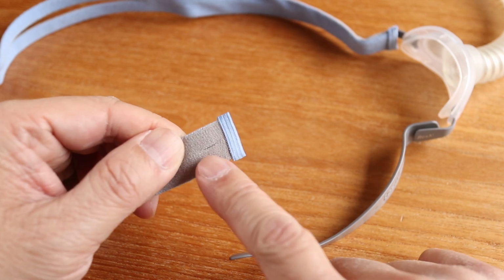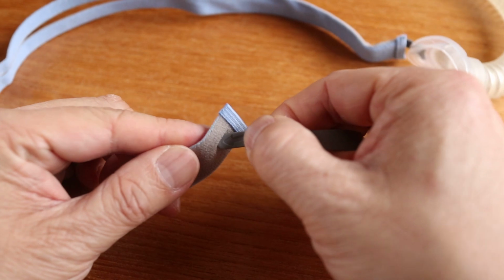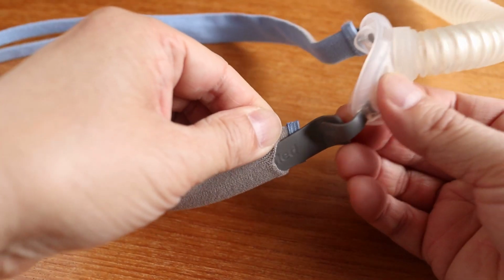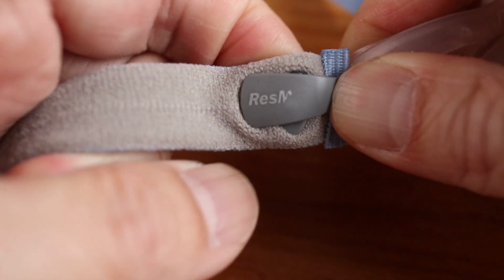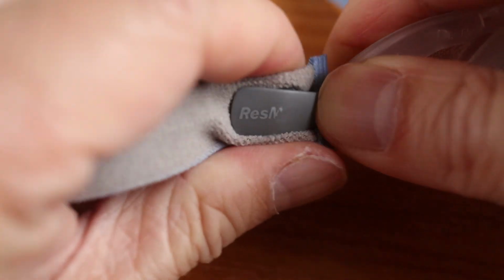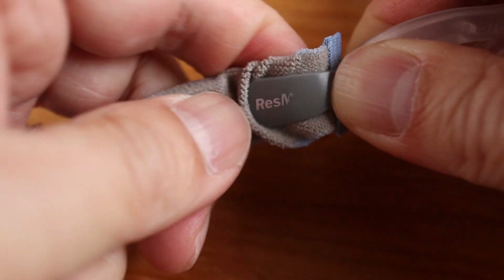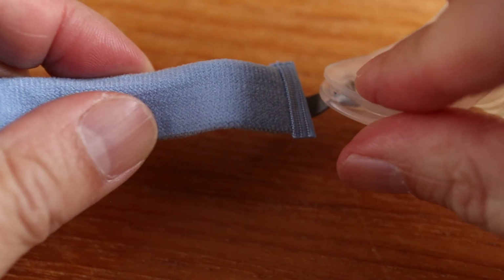Now on the other side, locate the opening in the fabric and I'll slip in the plastic arm with the arrow mark facing me. And here's a closer look at how to secure the headband to the connector. This is really quite simple, so you shouldn't have any problems doing the replacement. But once you've got it on, this is going to feel like new again.